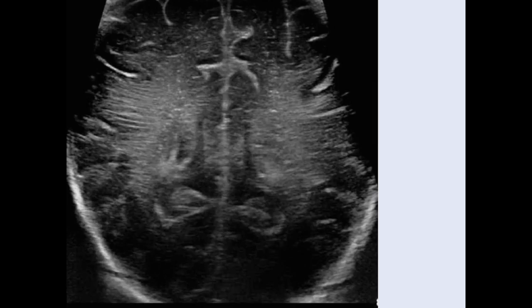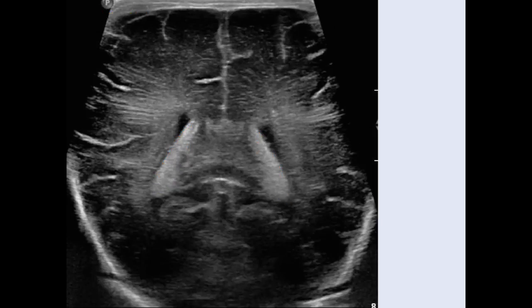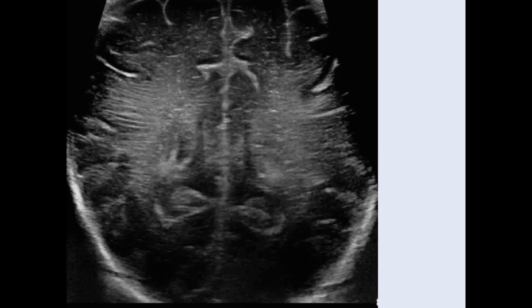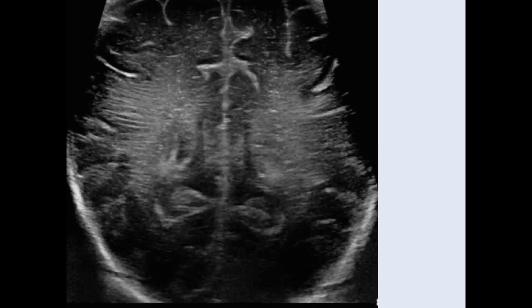Slightly more posteriorly still, now we are in the periventricular white matter of the posterior brain. This is the normal echotexture that we should encounter. The periventricular white matter does have a diffuse low level of echogenicity, but comparing to the echogenicity of the choroid plexus, it is not as bright. That is an important thing to note when we're looking for periventricular leukomalacia in particular.